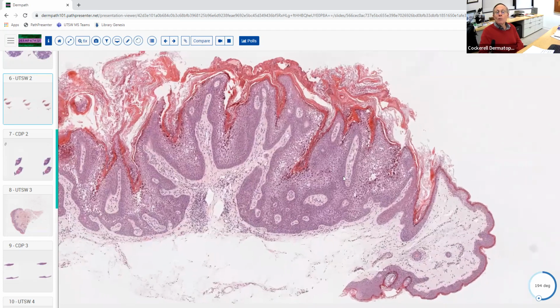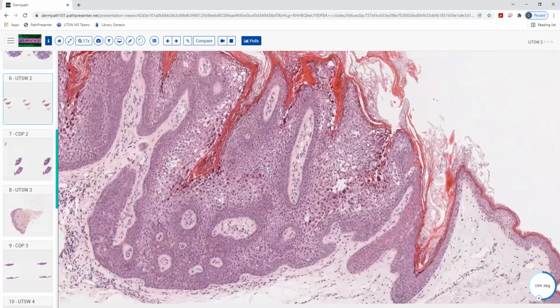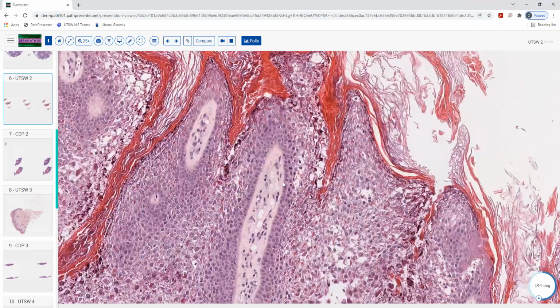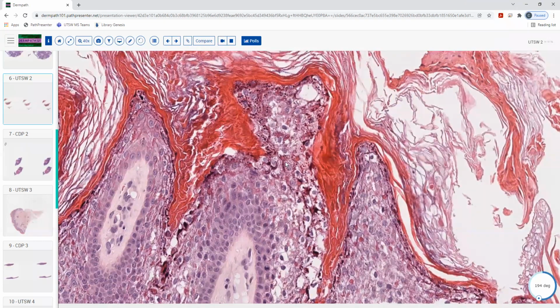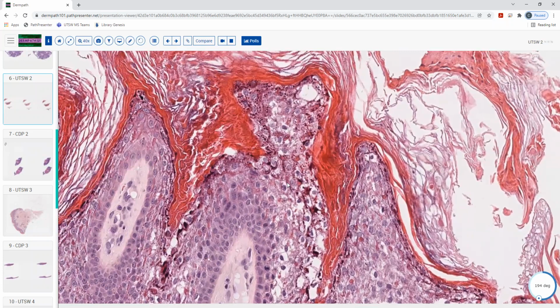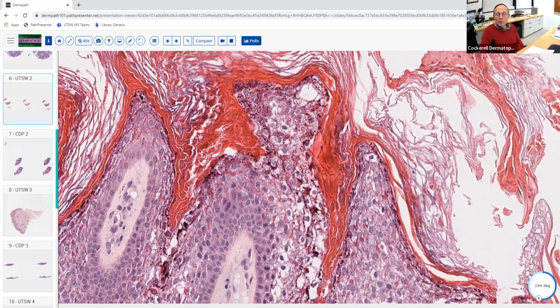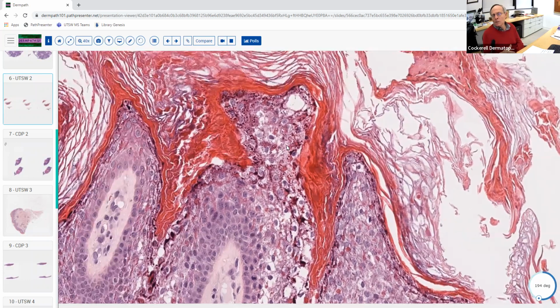And this is kind of where the action is, right? Yes. And so it kind of looked like there was some acantholysis going on in the upper portion of the epidermis here. Or really acantholysis? Do you think like necrosis or like dyskeratosis? I don't know. I think some of them like dyskeratotic, like a little more like red and like pycnotic. Yeah, I agree. There are some cells that are probably undergoing a type of dyskeratosis, or maybe sort of apoptosis in a way. There might be a couple of acantholytic cells here, but it's not the classic pattern of acantholytic dyskeratosis.